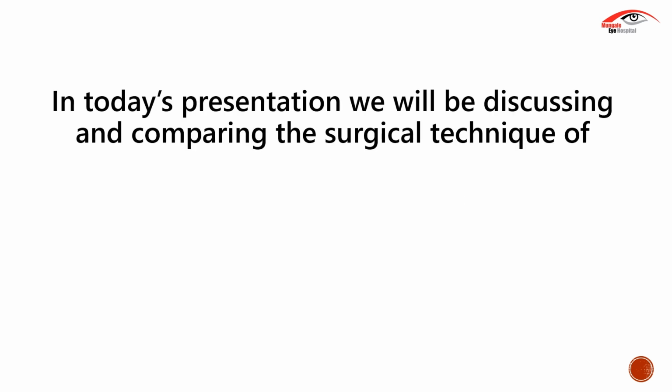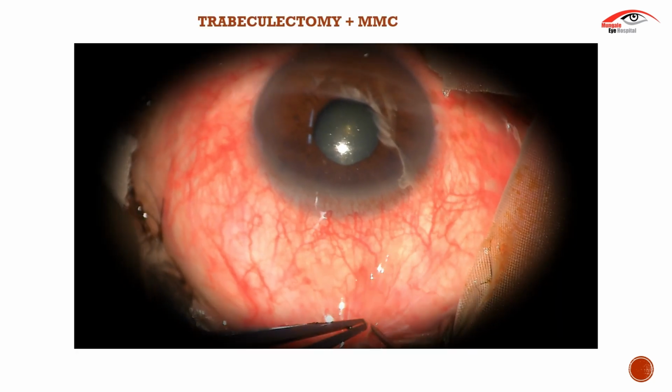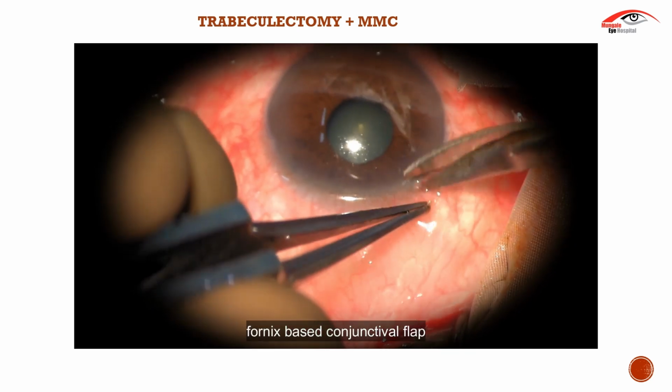In today's presentation, we will be comparing the surgical technique of trabeculectomy with mitomycin C versus gonioscopy-assisted transluminal trabeculotomy, hereby referred to as GATT. In the first video, we will be discussing trabeculectomy with mitomycin C. This surgery is an ab externo surgery.